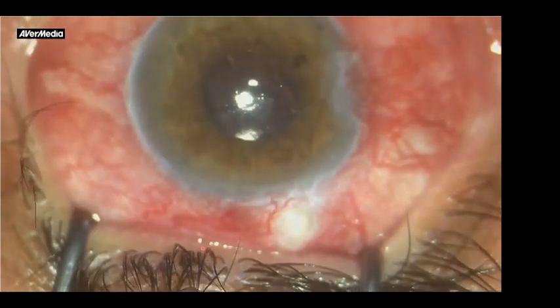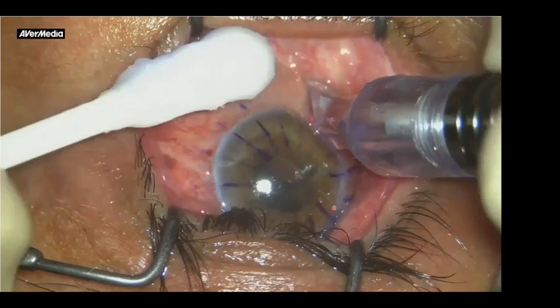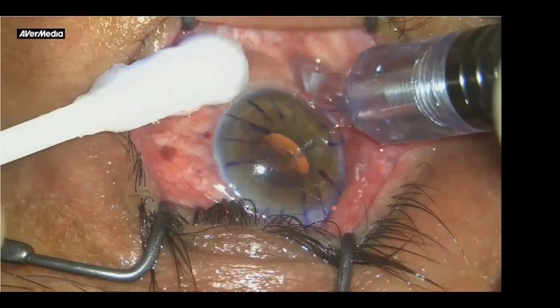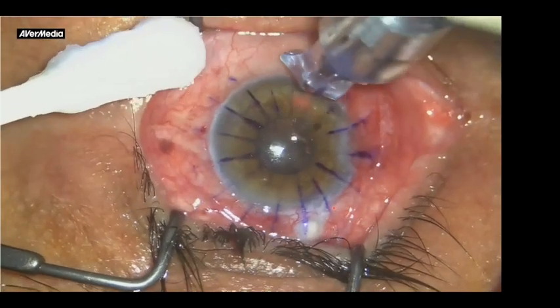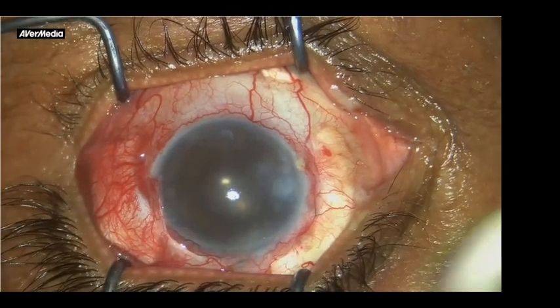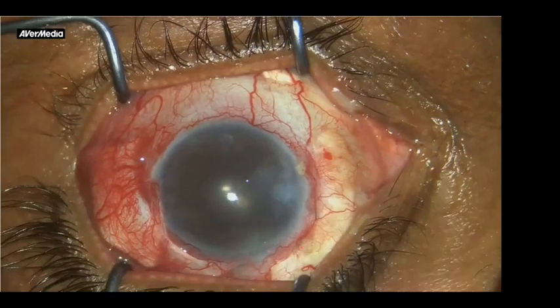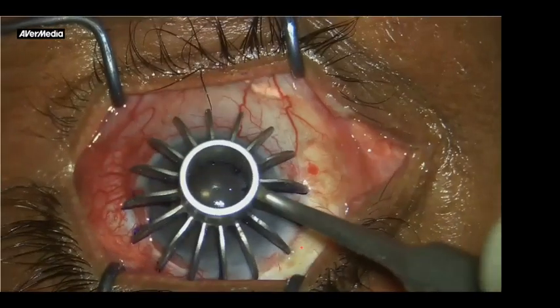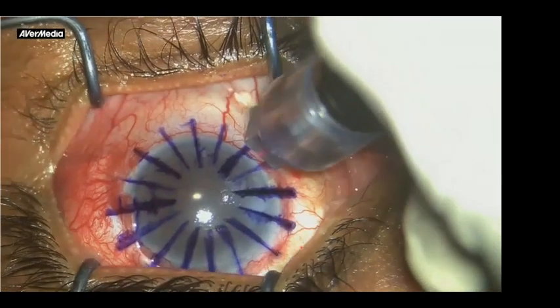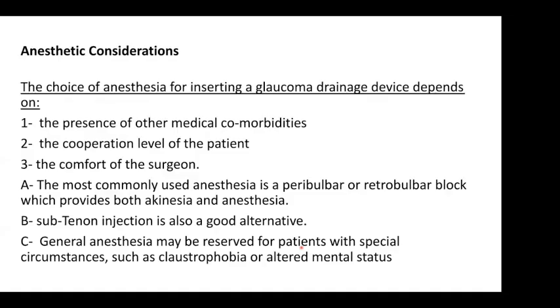Now in the OR, when you see a patient with this picture, so much adherent conjunctiva, there is no way to go for a valve, whatever dissection you do, so I just take a shortcut and go for diode. Again, here there is no conjunctiva. This is so obvious, but some patients, you will discover this on the operating table, so it's better to know in advance. If the conjunctiva is very adherent, I'll go to my beloved cycloablative procedures. There is no way to dissect a conjunctiva that's very adherent to the sclera.